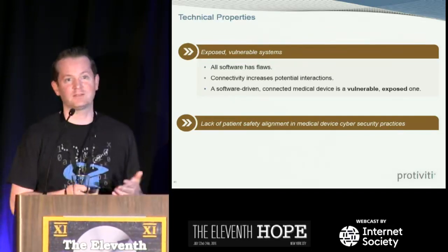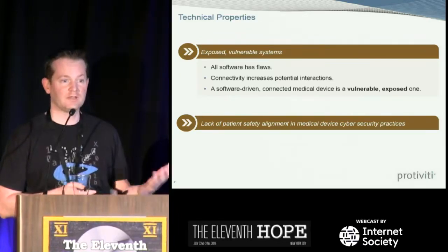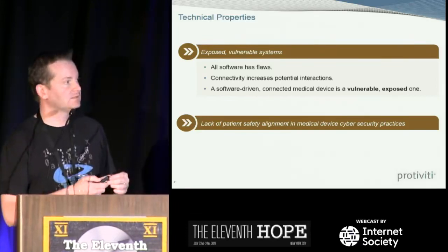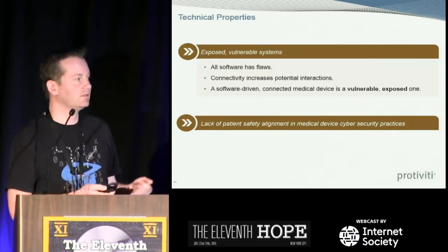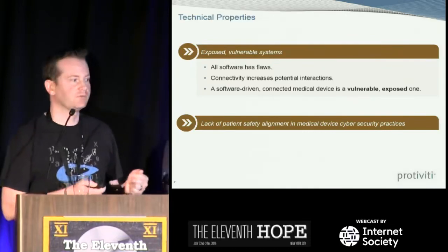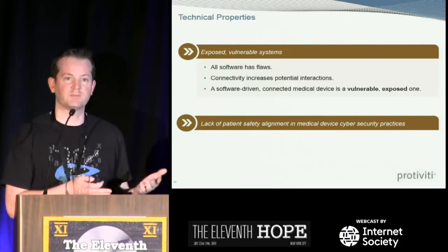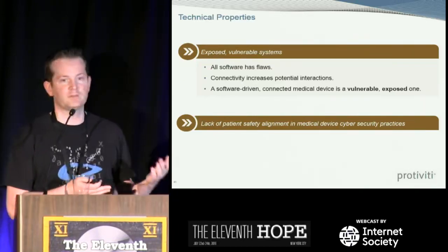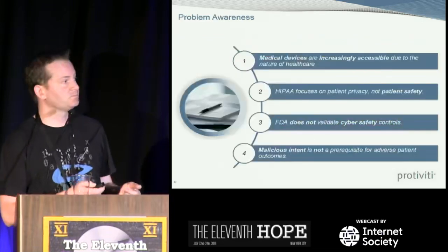And when you connect something that's previously not been connected, you're increasing the interaction points. So if you have this great idea to build a software-driven, connected medical device, it could be a vulnerable, exposed one. It's inherent to the thing that you're building. And then what we also see is a lack of alignment from a patient safety perspective in terms of medical device cybersecurity practices. We talked earlier that HIPAA certainly is a driver, but the potential impact from a patient safety perspective didn't seem to be as much there.